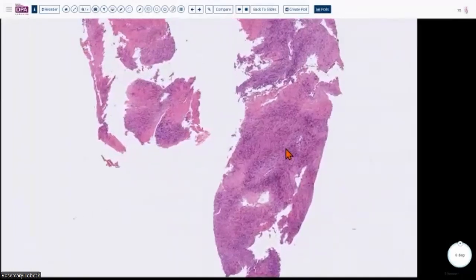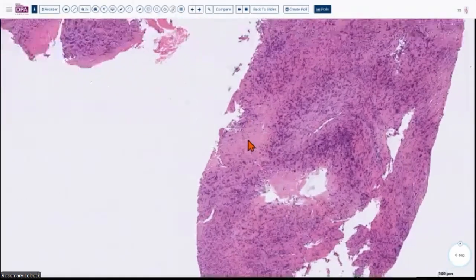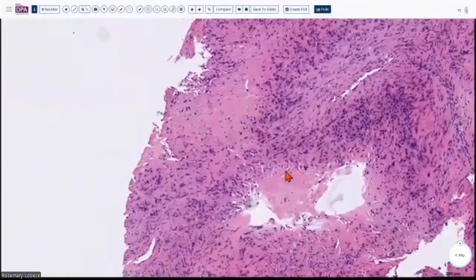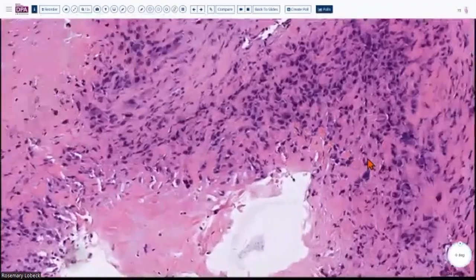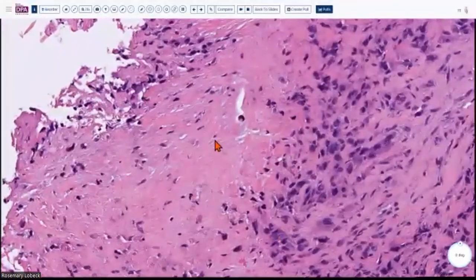So in the cellular area, we see there's some sort of organization here. So there seems to be a palisading of these nuclei. And then within the center of the palisade, there is sort of a degenerative type of, maybe a necrobiotic type of, maybe a granuloma-like formation over here with palisading cells. So when you look closer at these cells, there's not really much going on. It looks like maybe inflammatory cells, or maybe histiocytes around a granuloma, so doesn't look like much, right?